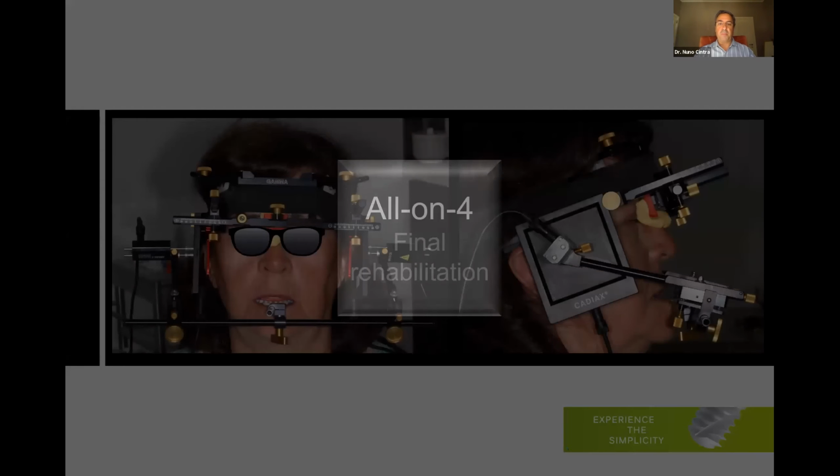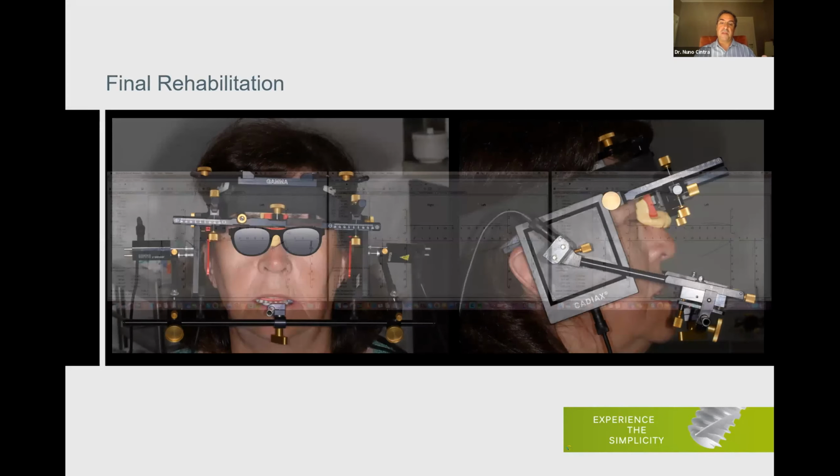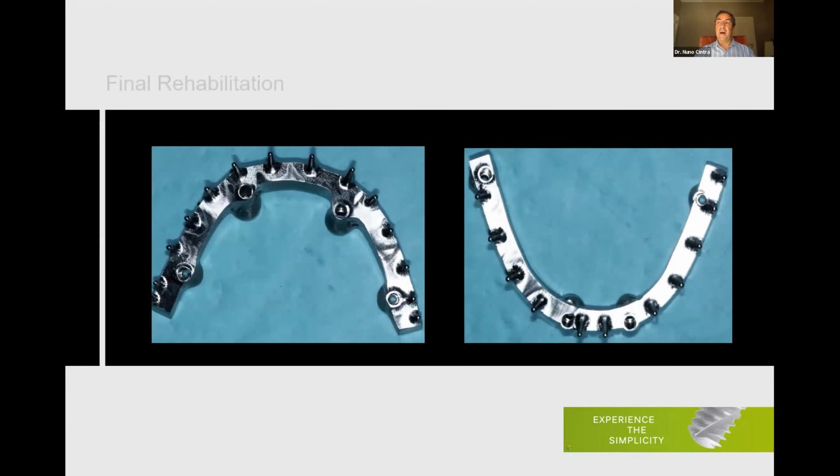The final rehabilitation. You know, a lot of people ask me, when do we go for the final rehabilitation? 4 months, 6 months, 8 months, when? Well, let me tell you my opinion about that. Nowadays, for the final rehabilitation, we always do a condylography according to the Slavicek technique. We have these tracings and we do the rehabilitation upon these findings, mainly if we are doing a bimaxillary case.